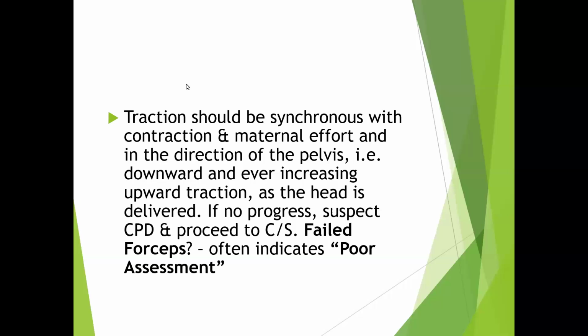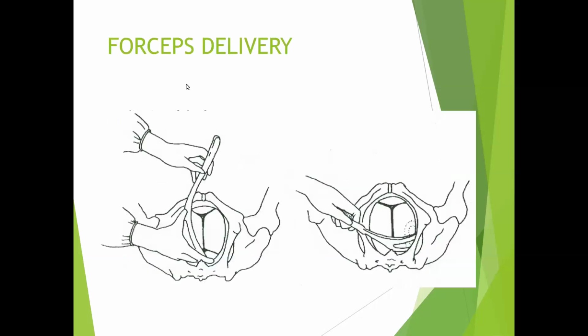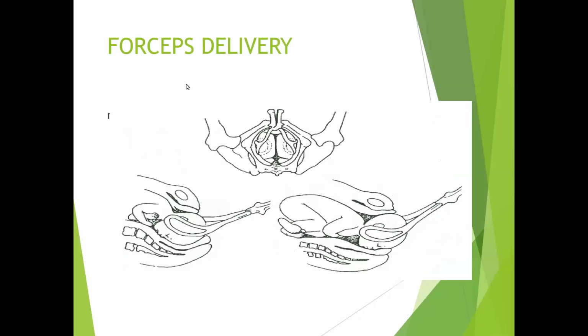When do you abandon the forceps delivery? You abandon the forceps delivery if you have failed attempts about 2 times. So you try twice, knowing that all the prerequisites are met and that you apply the instrument well, and then you fail twice. Others also use a time range of about 15 to 20 minutes. If within that time range all you have done is not helping, and there's no descent with every effort, the baby's head is not out, you don't go further, you throw in the towel. So these are images to show the forceps delivery.